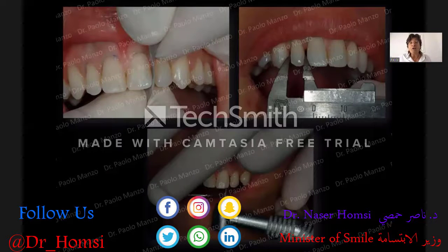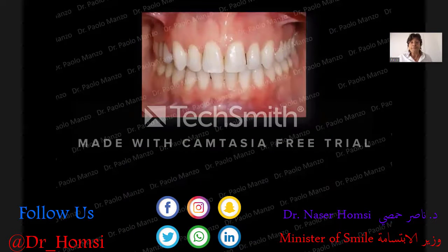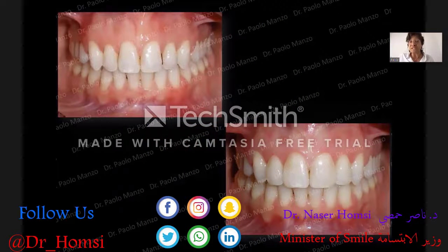And now very, very small preparation. So the preparation is very, very light. We don't need to make a lot of preparation like this. So it's a very conservative one. And after, the prosthetist takes a very sharp, very precise impression. And you can see how much it changes when we have these additionals to the distal surface of these teeth. So mesial surface and distal surface were completely changed. And also the relationship between the anteriors is completely changed, and the aesthetics a lot also.